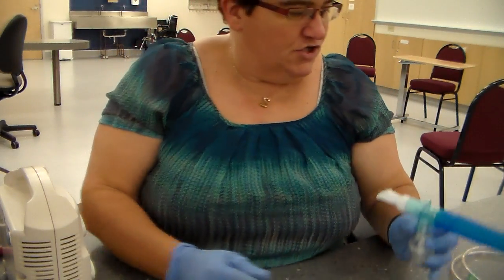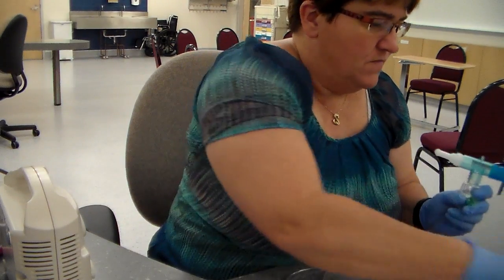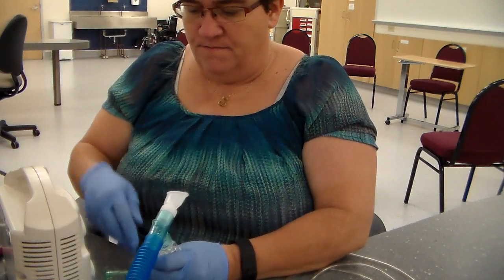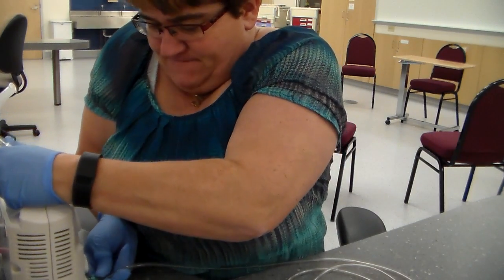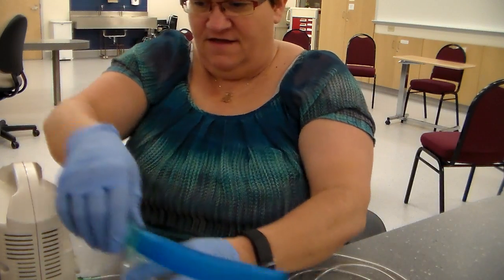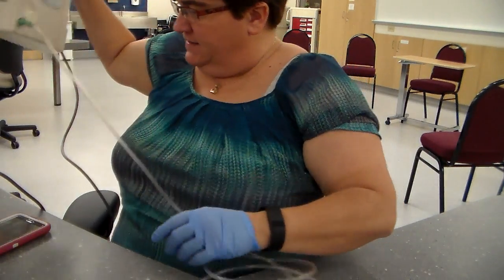Now, you're going to make sure that your air source is ready to go. For this, I'm going to use the machine. It's going to be loud, so I'm going to try to move the machine away from the camera as much as possible so that I can minimize the noise.